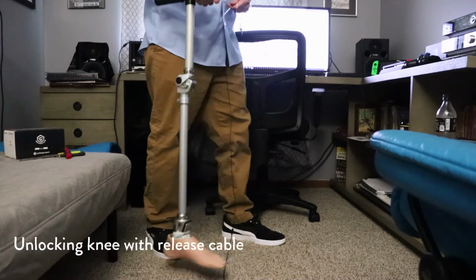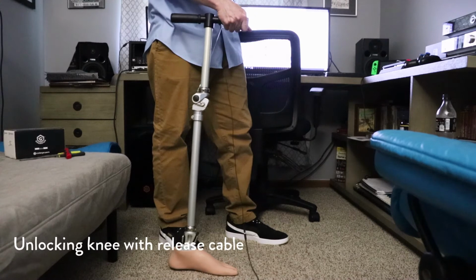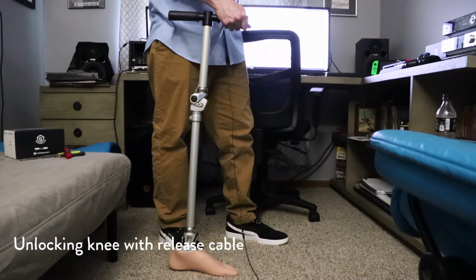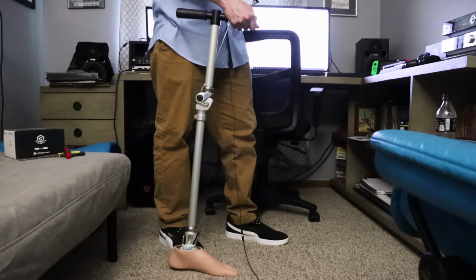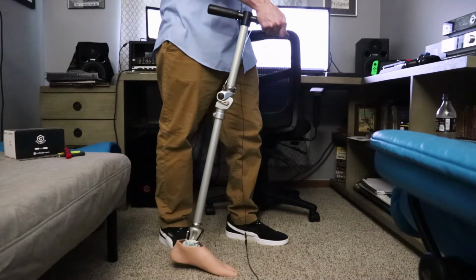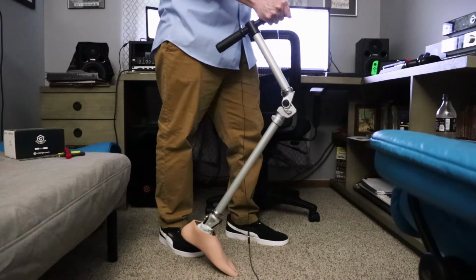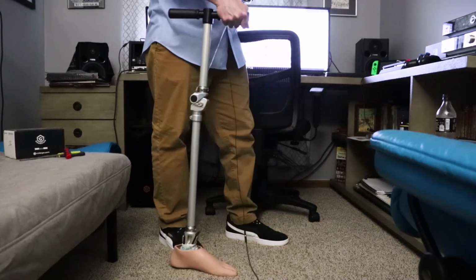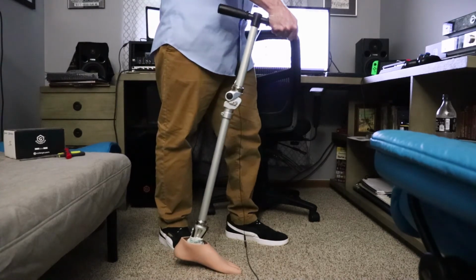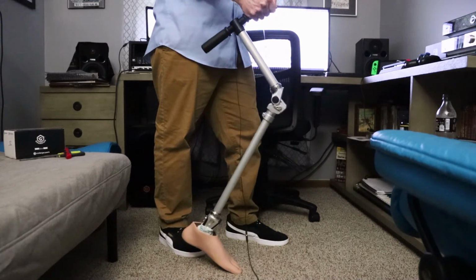Okay, so unlocking the knee using the release cable. Normally this would obviously be attached to a socket. I've got a T-handle here. But what's important to remember is there needs to be weight on the toe and off of the heel. So the weight needs to be on the toe, and then when you pull up on the cable, the knee will unlock. Now see how I have my hand on the front handle here? That's to make sure all the weight is on the toe. If there's any weight on the heel, it's going to make that lock very hard to disengage.